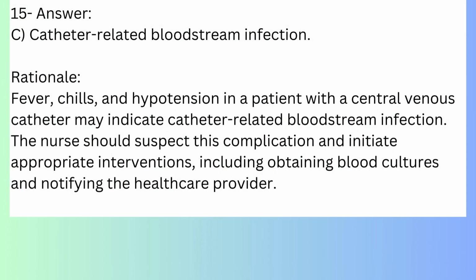Catheter-related bloodstream infection. Rationale. Fever, chills, and hypotension in a patient with a central venous catheter may indicate catheter-related bloodstream infection. The nurse should suspect this complication and initiate appropriate interventions, including obtaining blood cultures and notifying the healthcare provider.